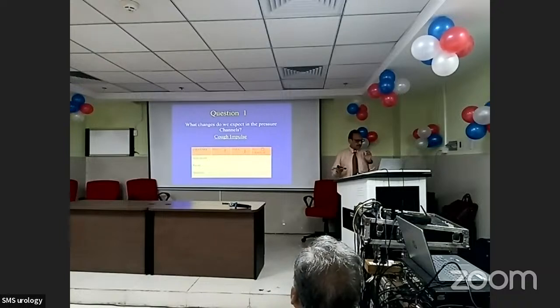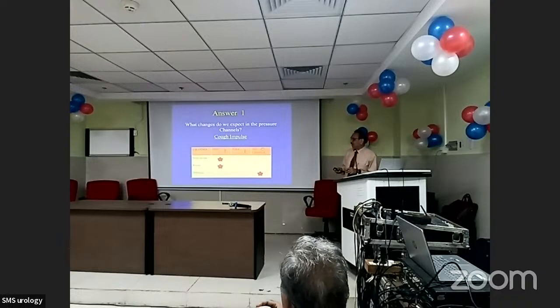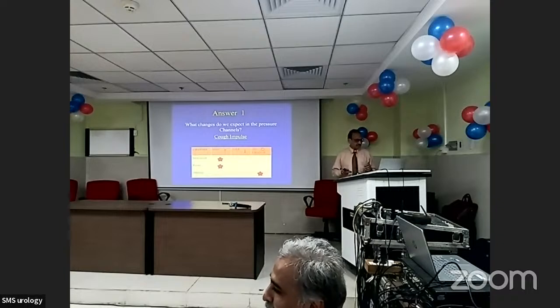What will be the change in intravesical pressure, rise or fall? What will change in rectal pressure, rise or fall? Intravesical pressure? Right, very good. Rectal pressure? Right. Detrusor pressure? No change. Absolutely right. So, full marks for the audience.